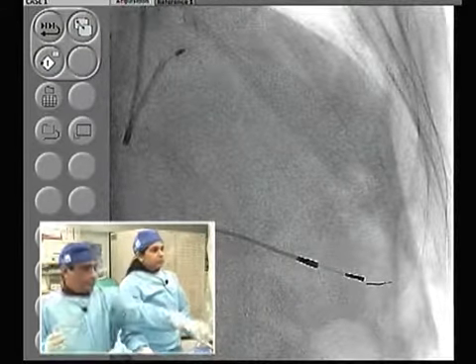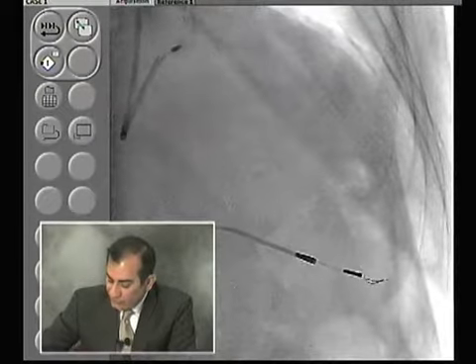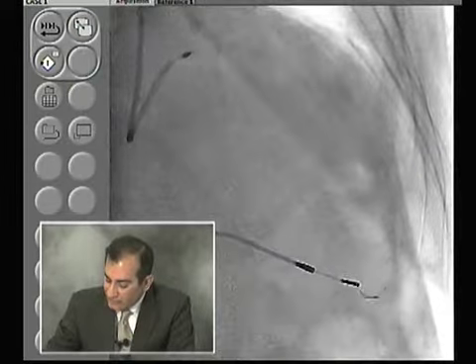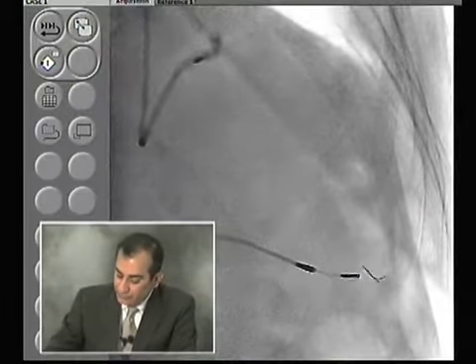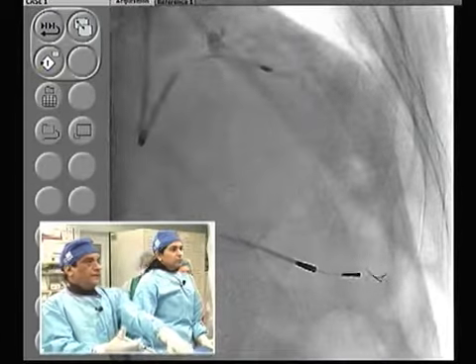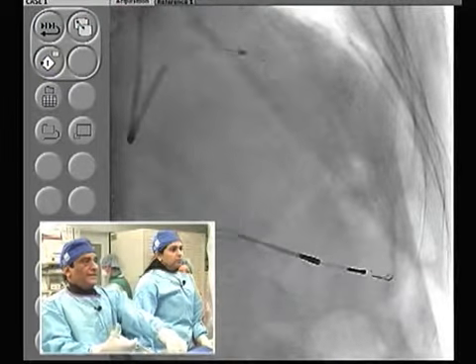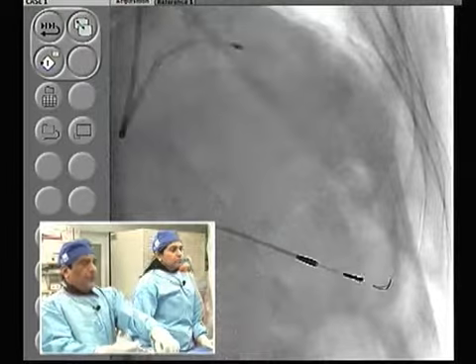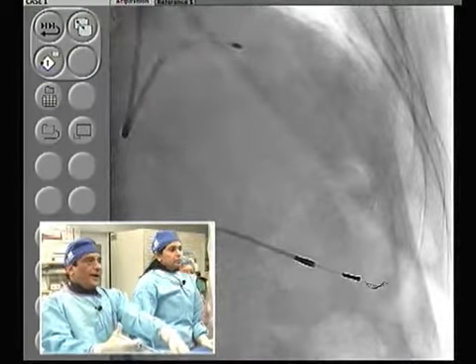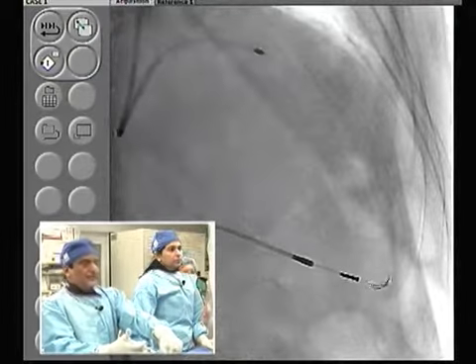Samin, in the data you presented from Mount Sinai with the bifurcation results, which bifurcation strategy did you use there? We actually used two. The conventional stenting, which is basically putting a stent in the main vessel and going through the side branch if needed, and about 30% of those 50 cases required another stent in the side branch.